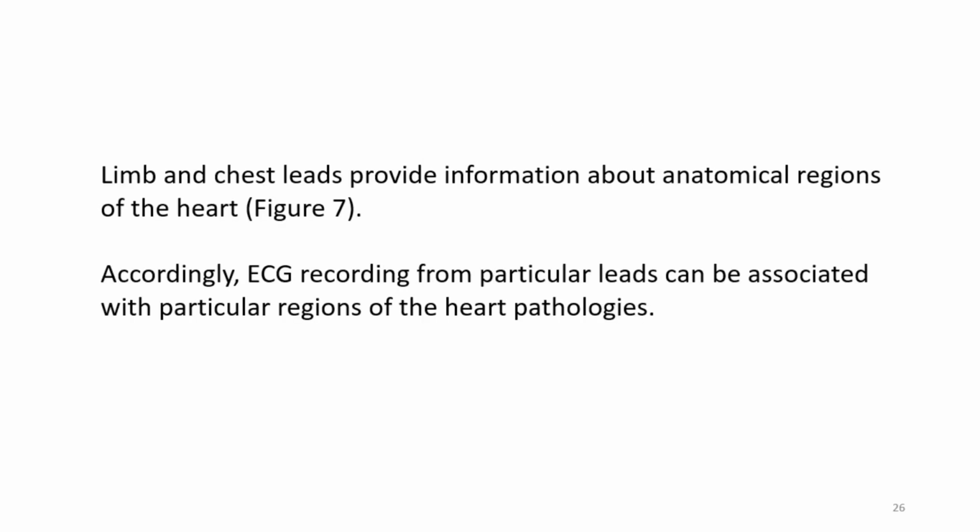Limb and chest leads provide information about anatomical regions of the heart. Accordingly, electrocardiogram recording from particular leads can be associated with particular regions of the heart pathologies.